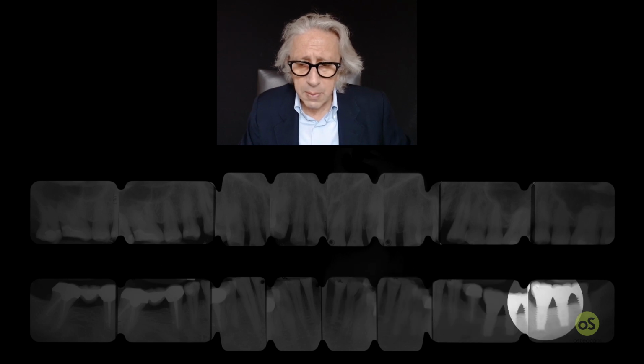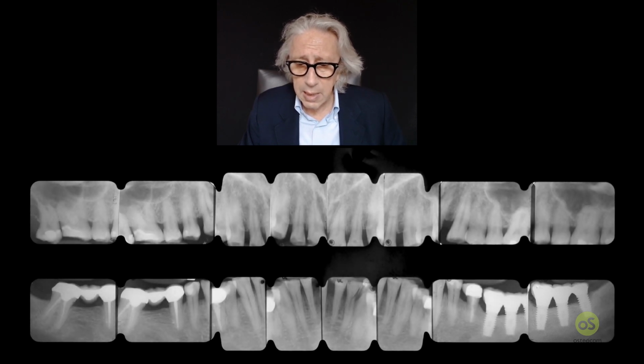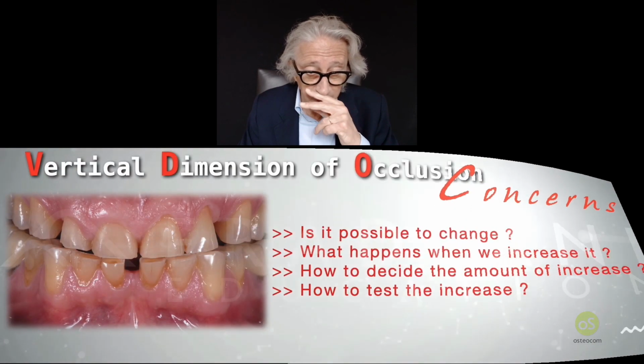Plus, of course, on 3 implants, you can decide to remove everything and to do a new prosthetic structure, or to keep the prosthetic structure that was working very well for many, many years, and to cover it with new ceramic, because you have to increase the vertical dimension so we can create space. Preparing minimally the ceramic work, then you can bond the ceramic to the ceramic. And that will be very challenging, but very nice. We do it, and sometimes it works very well. So those are the X-rays that show all this.